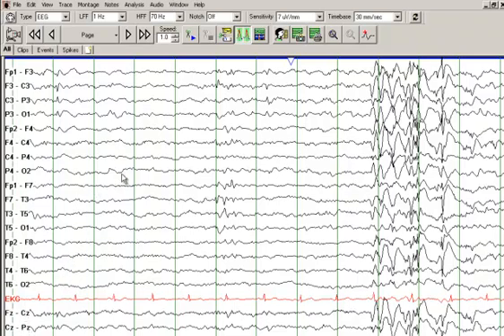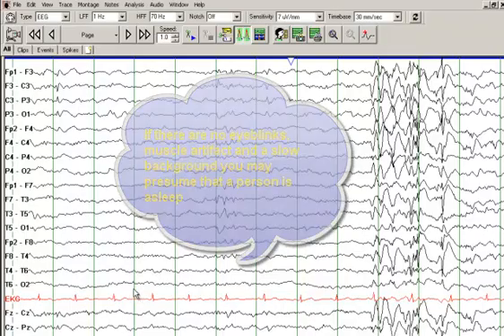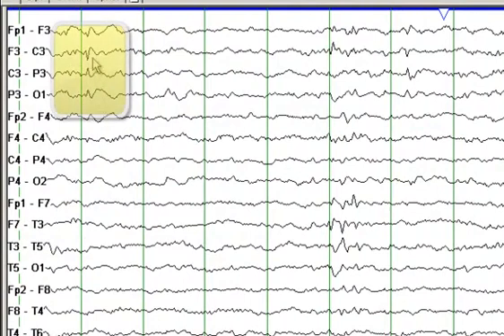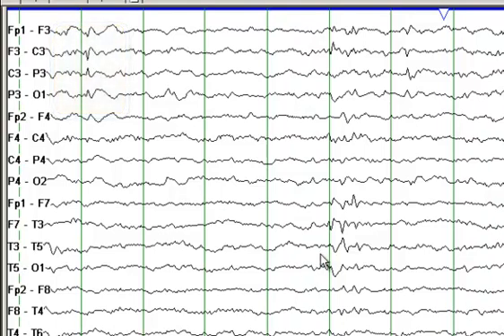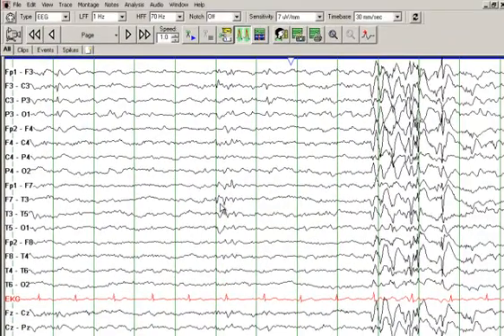Looking at this EEG, there are no eye blinks, there is no muscle artifact, and there is slow background, which tells you that this person is probably asleep at this time. A striking feature is the sharp wave which phase-reverses at C3, the left central head region — so a left central sharp wave. Then you have a sharp wave at T3, with phase reversal at T3, showing maximal negativity in that location.